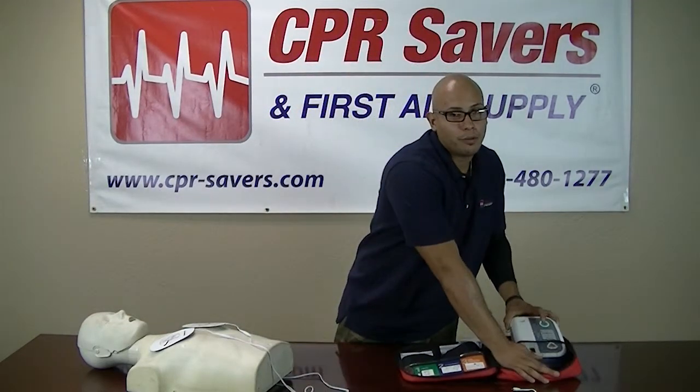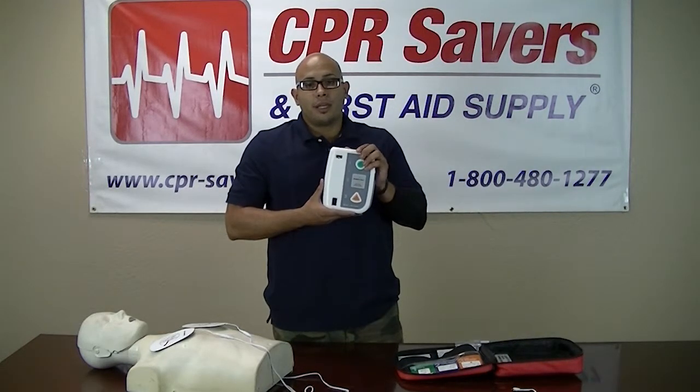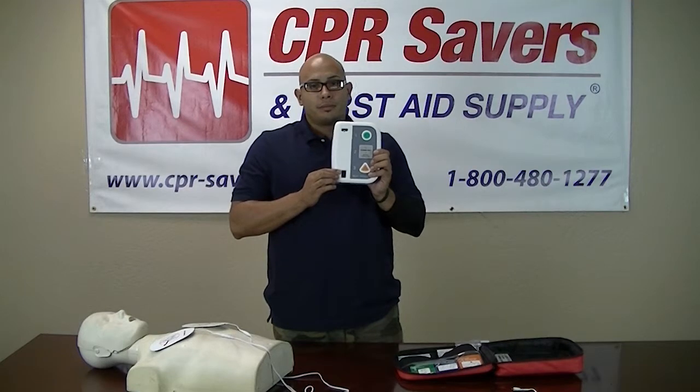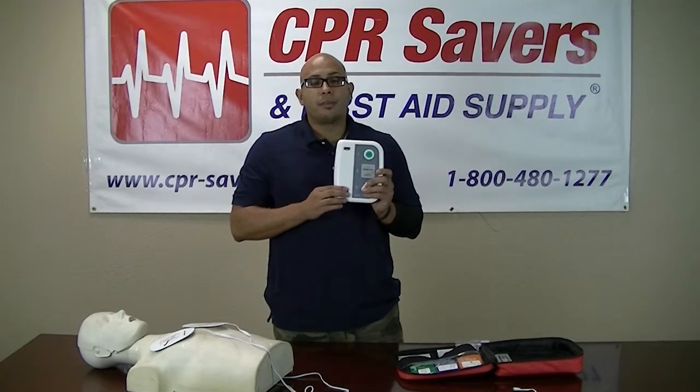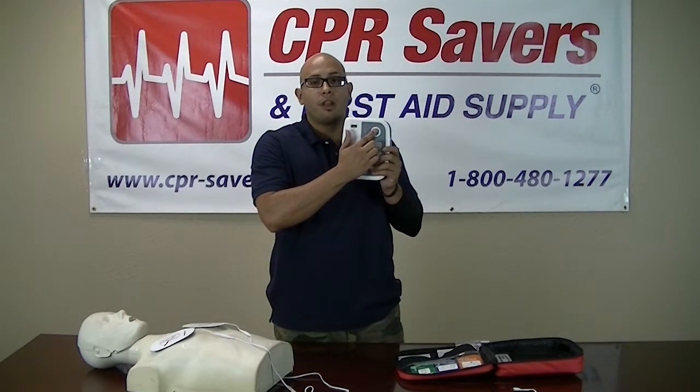The indicator window found on the bottom left corner of the front panel indicates which of the eight scenarios is currently being selected. To operate the trainer, simply press the green button on the top of the front panel, then follow the prompts.